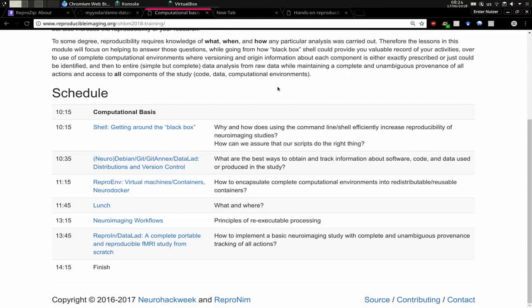Now, if you don't have the capability of naming things at the source, and that's true of some scanner centers, then you can learn about additional characteristics of HeuDiConv, which allow you to create what's called a heuristic file, hence the name Heuristic DICOM Converter. That's where HeuDiConv comes from: you can take either existing DICOMs that are not in that format and convert them to BIDS automatically through this heuristic, or current DICOMs that are not labeled that way. So I just wanted to put that out there, and if you have any questions, talk to Jarek about ReproIn naming.